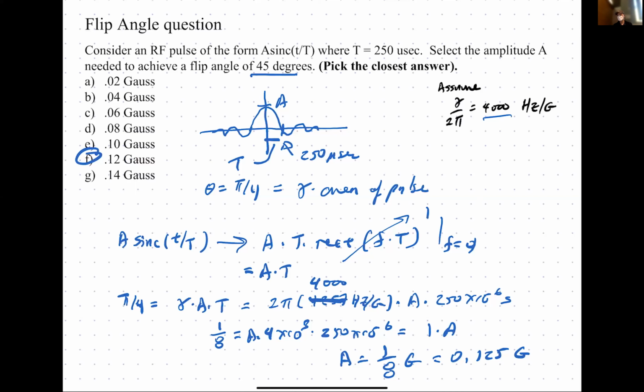All right, so that's the first practical problem we've got. This is the type of calculation that goes on in MR scanners every day. It's probably being done thousands of times right now. Every time someone enters a flip angle, the program has to calculate what B1 amplitude to use, and that's being done right now. Okay, in hospitals all over the world.